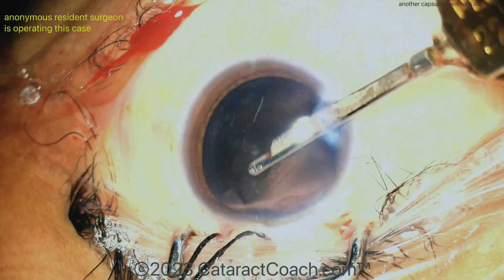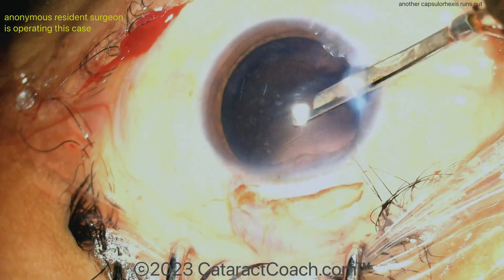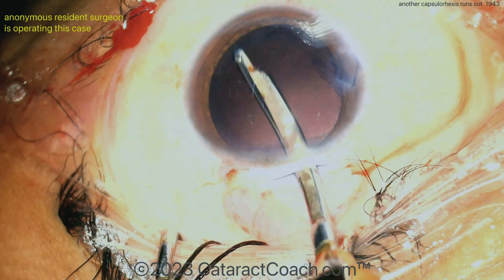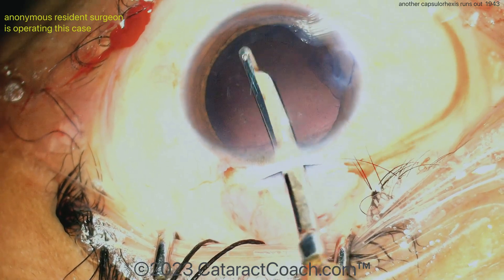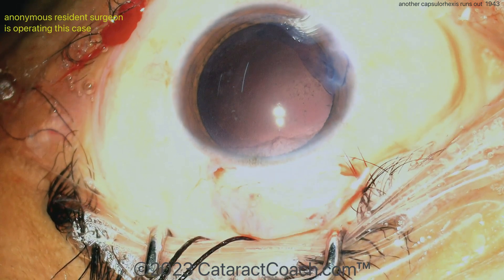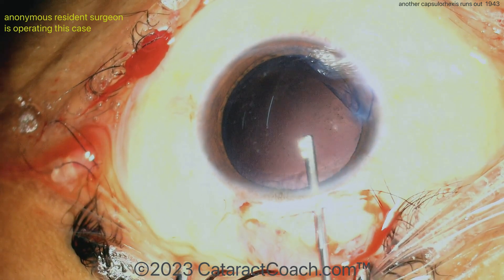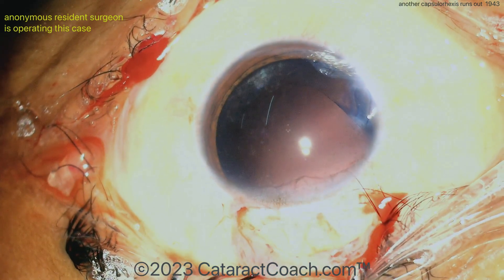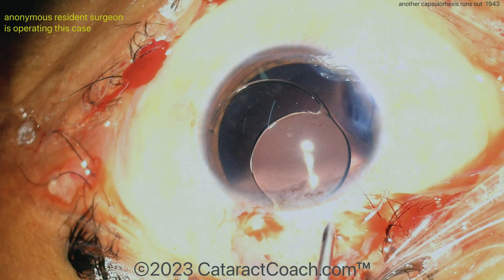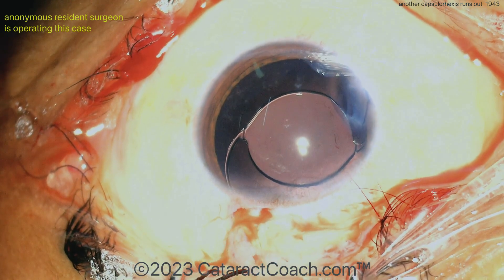The rest of the case is going to be just fine. The lens is going to go in the capsular bag and you can have a very nice outcome. Is it going to be hydro-implanted or visco-implanted? I'd be cautious about being too aggressive with the cortex removal in the area where the capsular rhexis ran out — if you inadvertently grab the capsule and put traction on it with the vacuum, you can cause it to zip all the way to the back. Here's the viscoelastic, probably HPMC — hydroxypropyl methylcellulose. Here comes the lens; looks like a single-piece PMMA lens, and that can go inside the capsular bag. There's the leading haptic in.